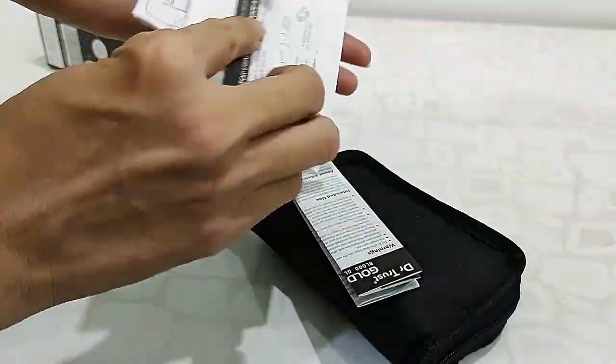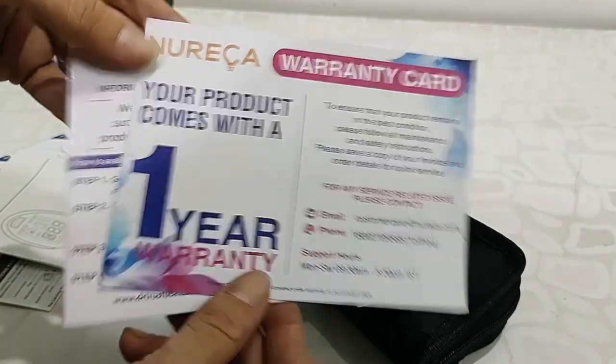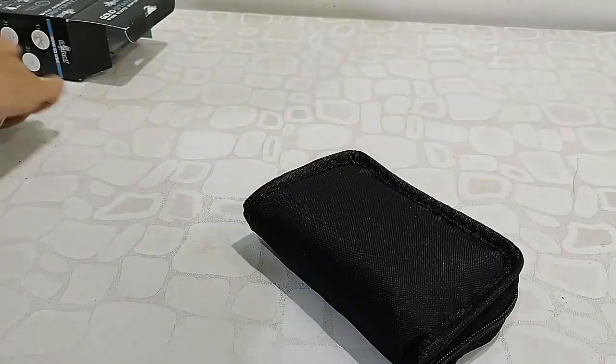I got some documentation like a warranty card, user manual, and other information documents.